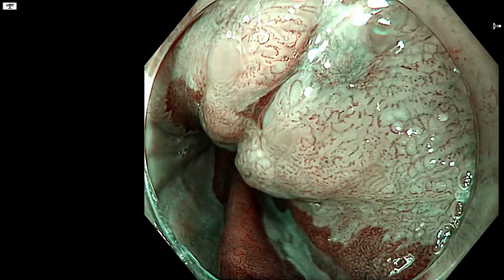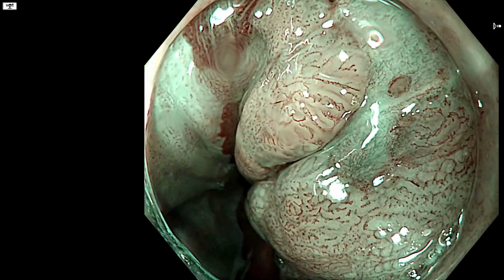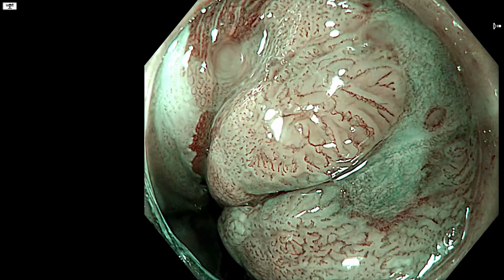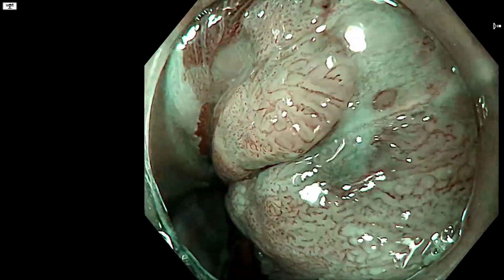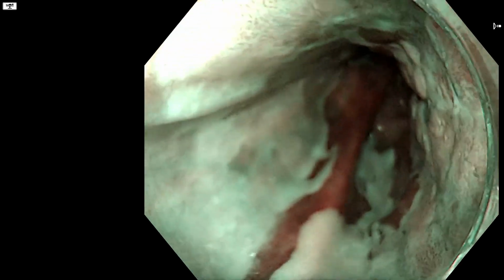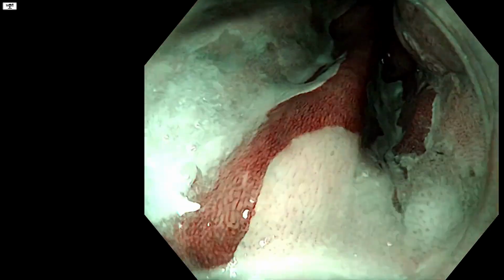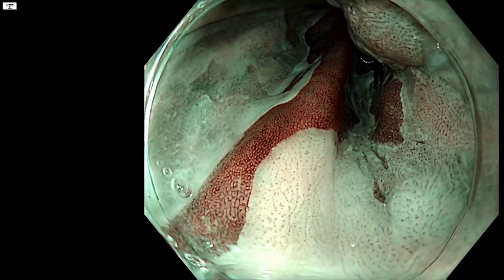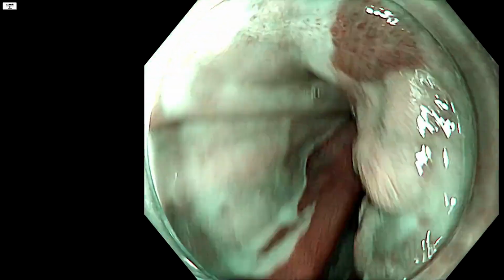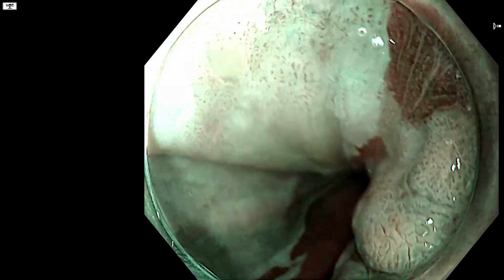And as you come back, you can again see some which are bridging two of the palisades here, especially now in the center of the image if I freeze it here. So this is for sure squamous dysplasia. And then the next question is, where does the dysplasia extend to? So we will show you Lugol in a minute, but first we want to show you with virtual chromoendoscopy. So it is not so easy to see the borders of this.